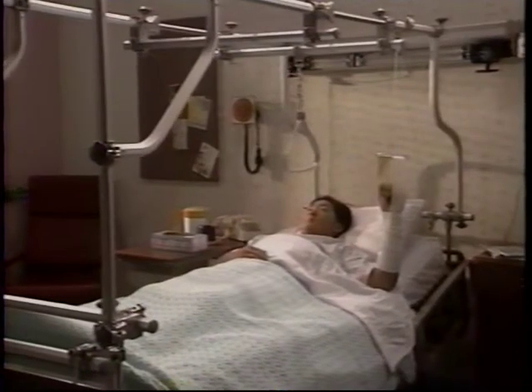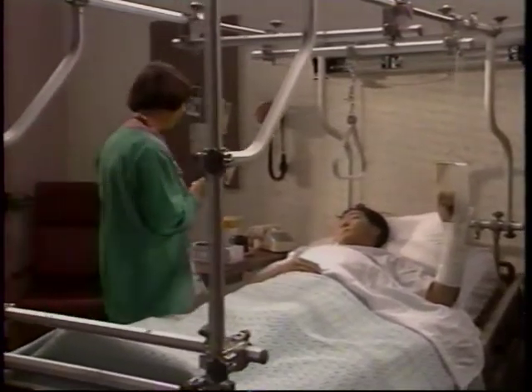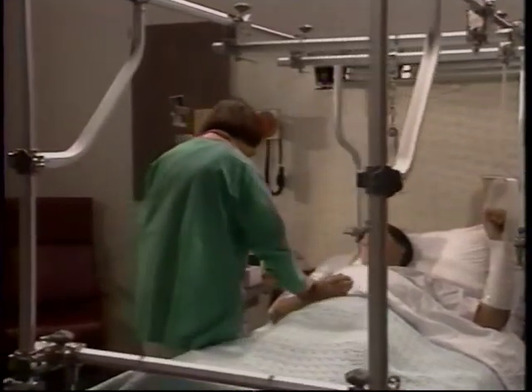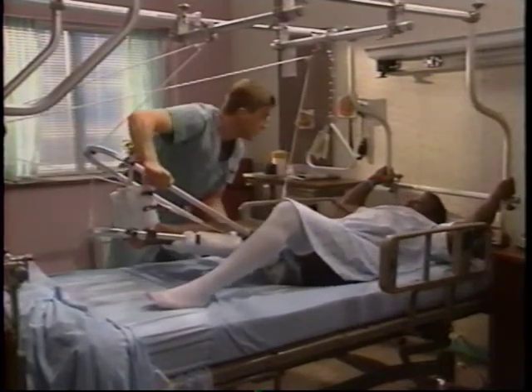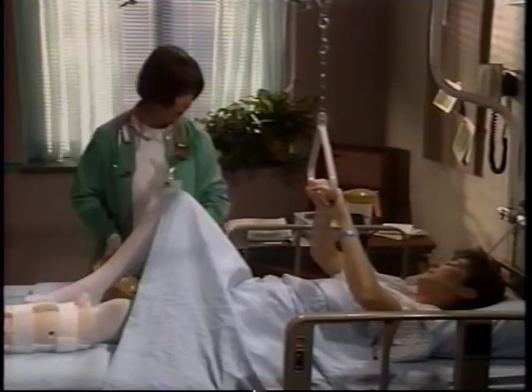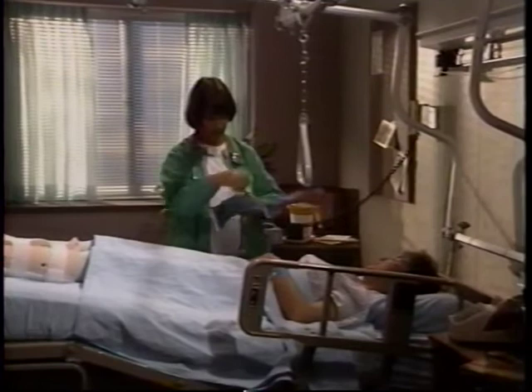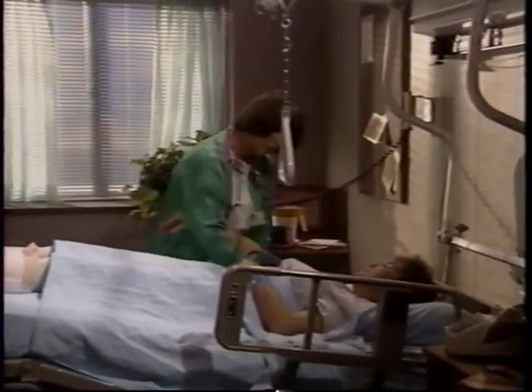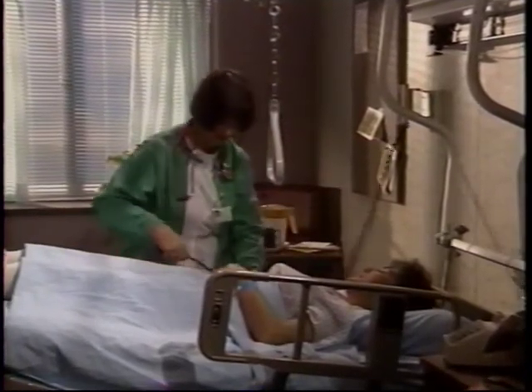Patients who require the use of traction after traumatic injury, orthopedic surgery, or as a corrective measure need specialized nursing care. This involves an understanding of traction equipment, methods, and mechanics in order to provide patient care and maximize patient comfort. Patients in traction run the risk of developing certain complications. By using careful monitoring and assessment techniques, nurses can be very effective in the prevention and early detection of these complications.